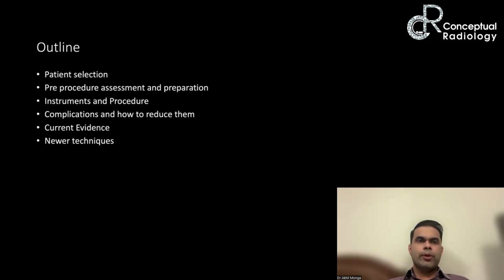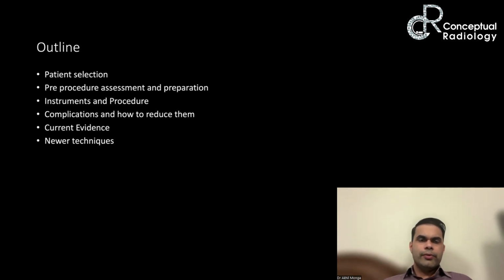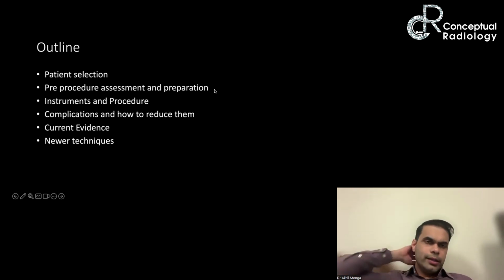Complications are the important thing here, because we can't really open the patient up, and if we get the cement in the wrong place, then we sometimes are dependent on the neurosurgeon. That's why it's a bit difficult to have people practicing vertebroplasty from our side outside, because some of the neurosurgeons and some of the orthopedicians are also doing this procedure. And then finally, definitely a theory question is there on this exam.